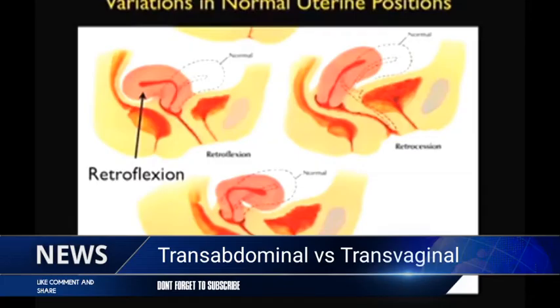Notice the retroflexed uterus. We have the cervix in the normal position, but the fundus of the uterus flops posteriorly. Thus, we may need to orient our hand in a more upright position to aim the tip of the probe more posteriorly to see the uterine fundus in the retroflexed uterus.